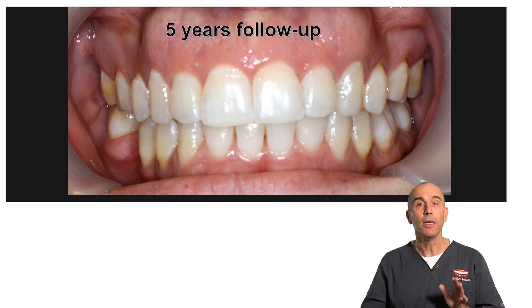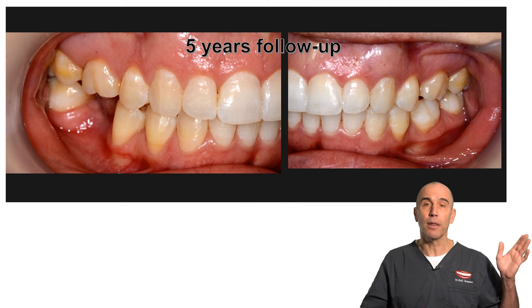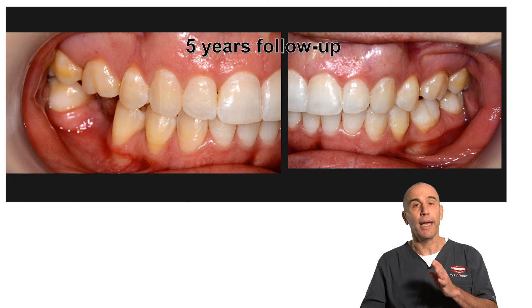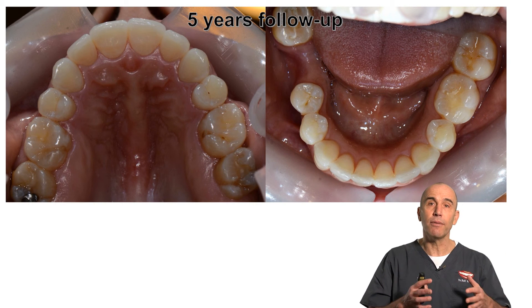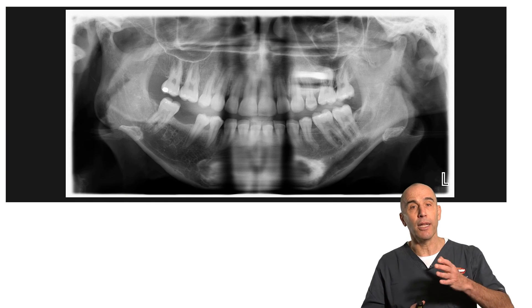We didn't extract teeth in the lower arch besides a molar that had to be extracted for prosthodontic reasons — not orthodontic reasons — and an implant will be placed there. You see the two arches very nicely aligned and the panoramic x-ray at the end of treatment.